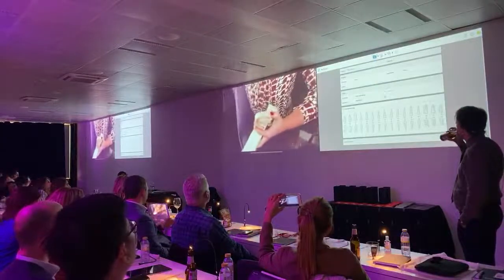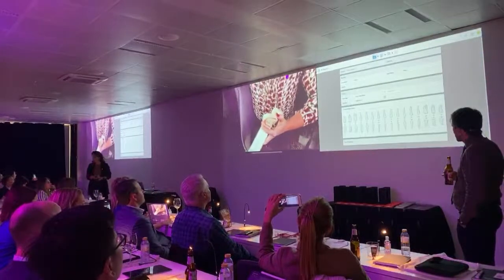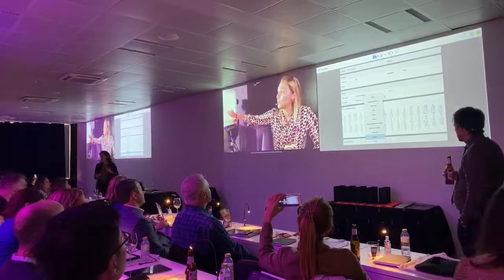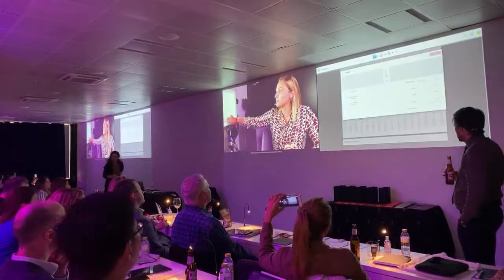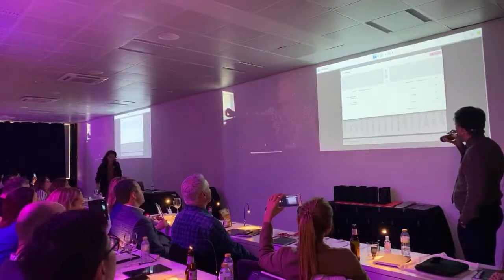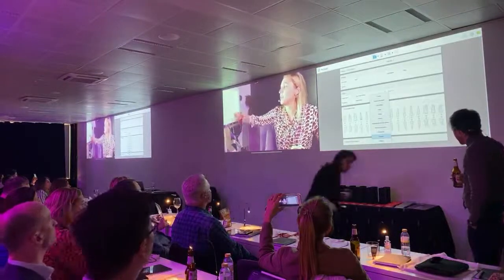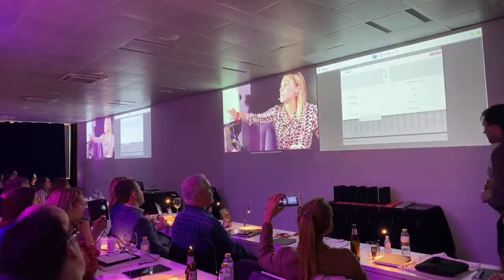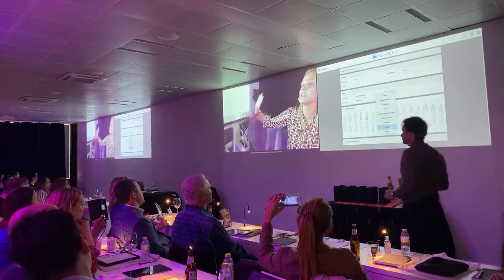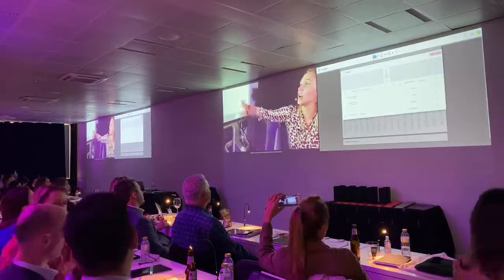You need to fill this form and type which tooth you're gonna scan, okay? And what it is. So 15, we have a veneer. I don't need to define now what is the material I'm gonna use, so I just choose lab preference, goes back. I touch 14, veneer, and then I copy from to 15 and go back. I'm gonna do until 13, okay? So we go fast. Veneer and copy.